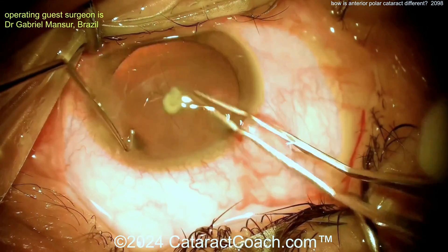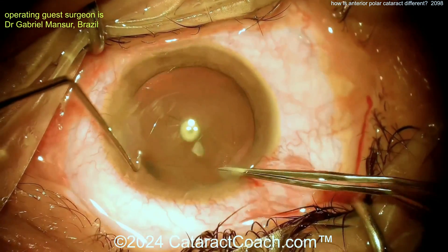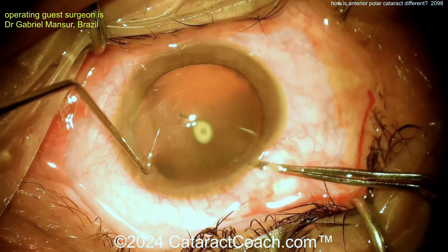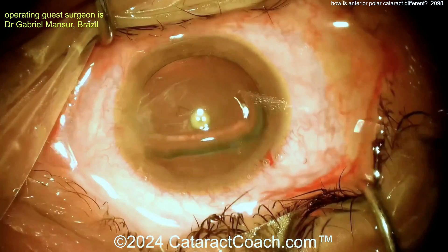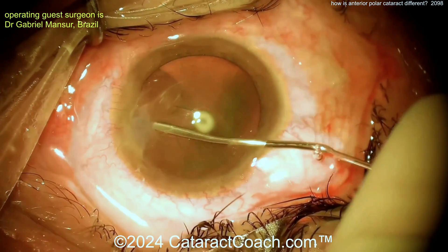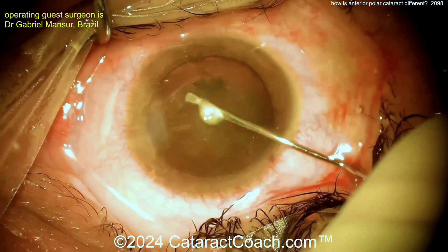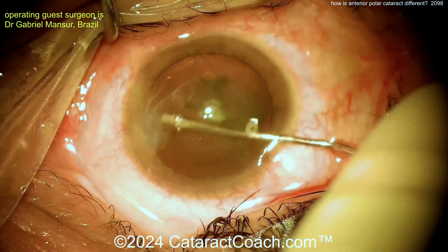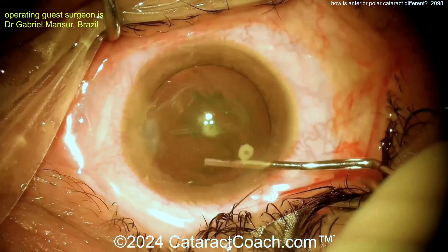But in this anterior polar opacity, even if the capsule is fragile there centrally, it doesn't matter — because when we get the capsulorhexis done, that anterior capsule opacity is out. Now there's just a little bit of a cortical or nuclear change from that polar opacity, but it's of no consequence. You can do the case routinely with normal hydrodissection. The polar opacity just pops right out of the eye.